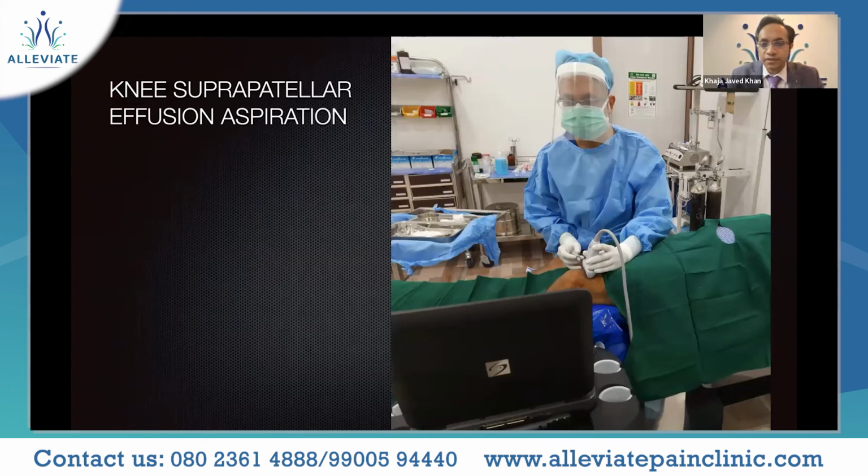Many of the time, patients having the inflammatory variety more compared to the degenerative variety of the knee conditions present with effusions in the suprapatellar region. And the ultrasound serves as a great modality for not only diagnosis, but even aspiration.